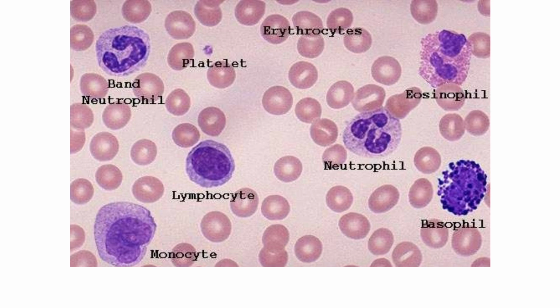If you look just below it, we have another granulocyte, which is basophil, which has coarse bluish granules, so much so that they obscure the nucleus. And if you look towards the left, we have both the agranulocytes, lymphocyte and monocyte. Lymphocytes have a high nucleocytoplasmic ratio. Here we are seeing a small lymphocyte. Lymphocytes can be small as well as large, and they have a purple nucleus and dense chromatin, and there is a narrow light blue rim of the cytoplasm. There's a band form as well. We'll see about it in detail. Now we are going to discuss each of these cells one by one.